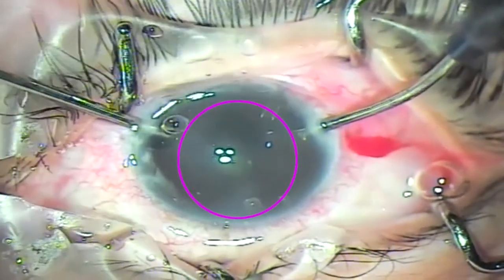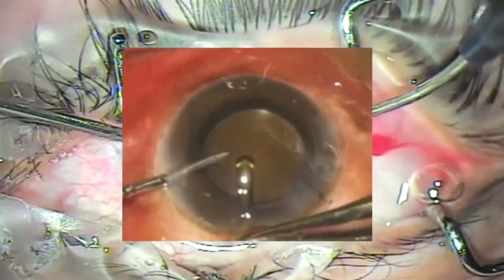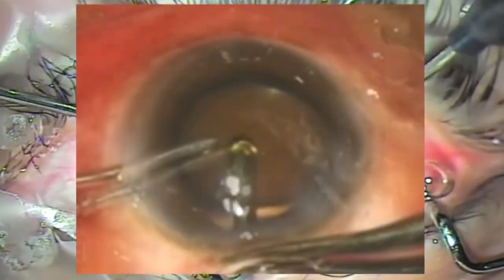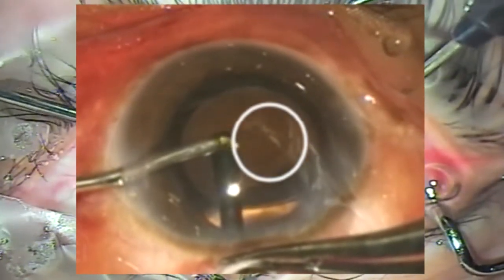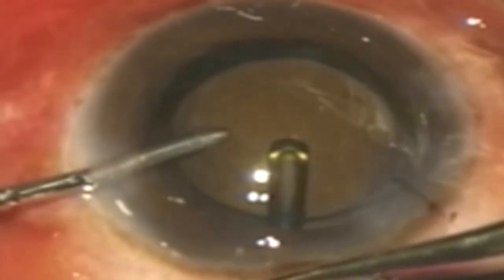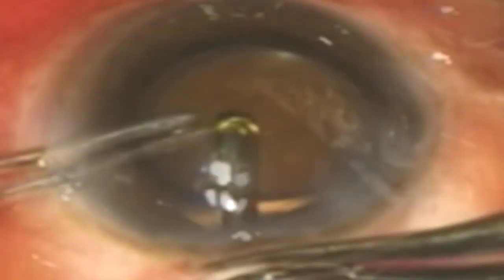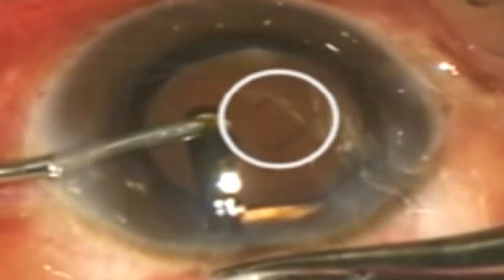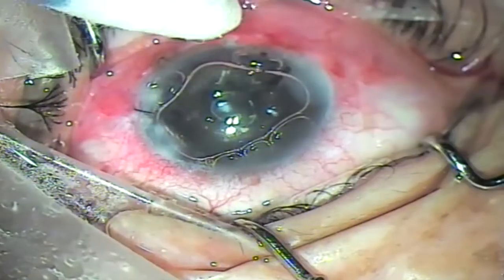The anterior hyaloid face is debulked and is deemed adequate when the surgeon is able to perform a primary posterior capsulotomy, as seen here, better in another case. Primary posterior capsulotomy also additionally renders the eye unicameral, achieved previously with the zonulectomy per se via the iridectomy. It is primary posterior capsulotomy which helps to identify completeness of the hyaloidectomy, essential for preventing recurrence. The endpoint is recognized when the AC deepens.